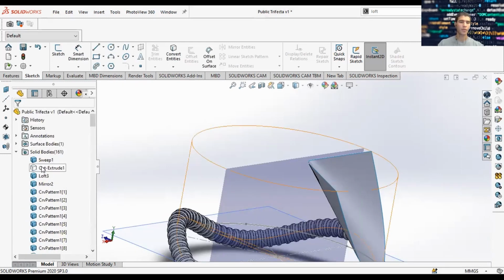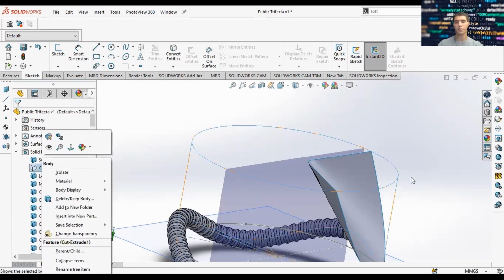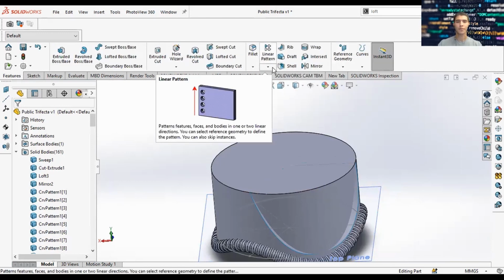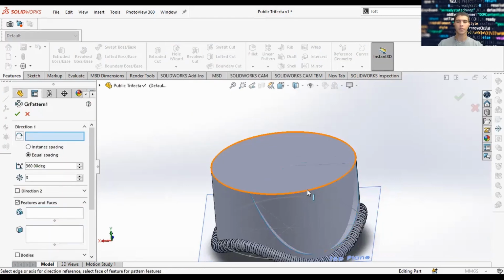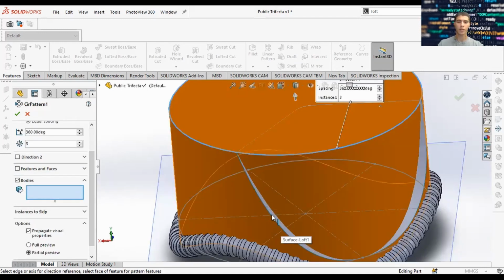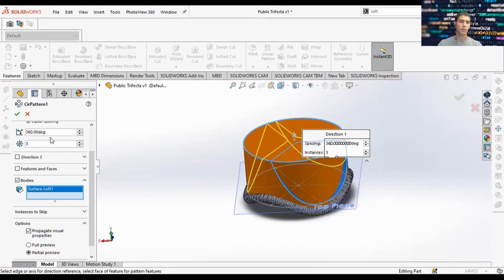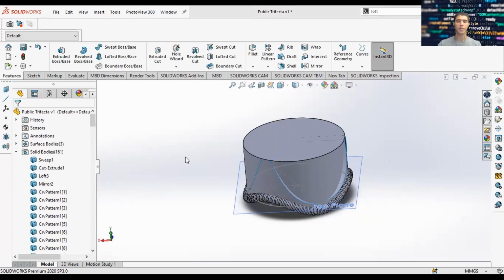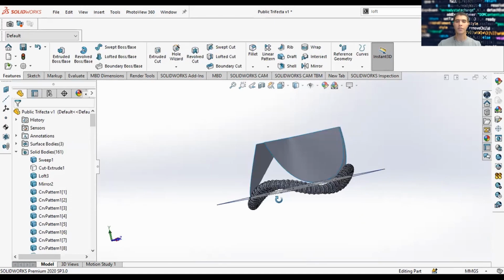Let's go back and bring back the solid body. And now we'll repeat this surface body along the circle. So let's go to circular pattern. Our direction will be this circle. And the feature, in this case the body, we want to repeat is the surface body here, Surface loft 1. And now when we hide our solid body, we have 3 spline surface lofts. Kind of cool.